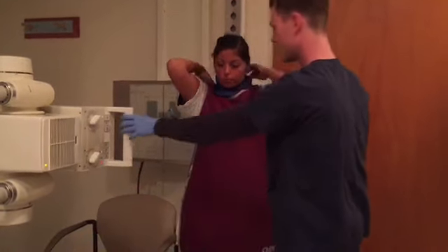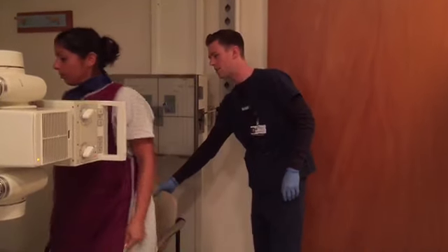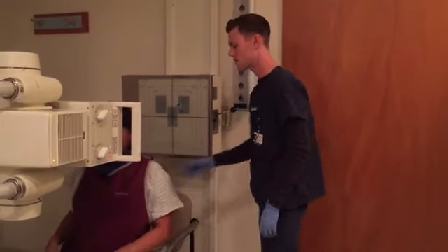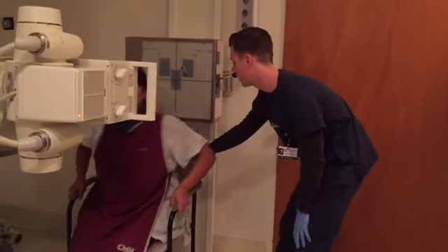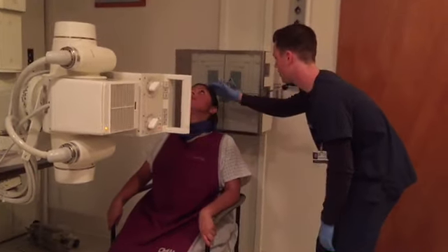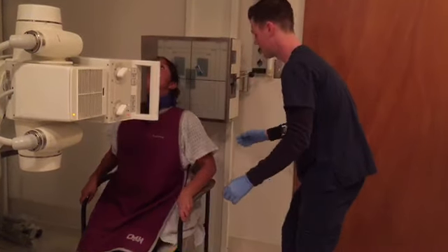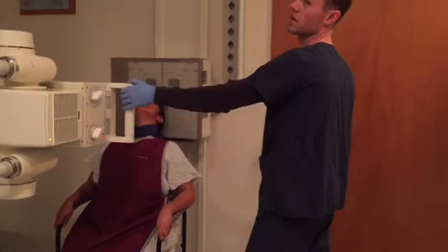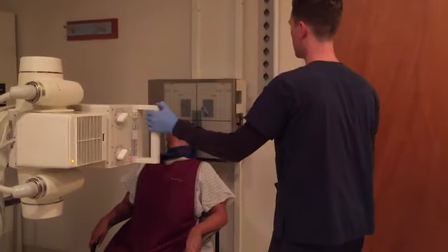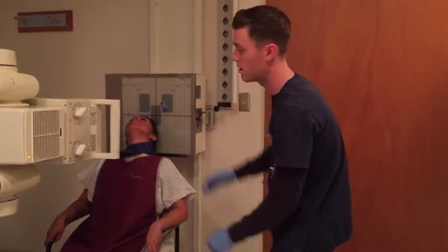Okay, Evelyn, go ahead and take a seat there. Sit towards the edge of the seat, that way you can lean back. This one's going to be a little uncomfortable to do, so go ahead and lean against the back of the chair. And then put your head back so that the top of your head is up against the board. You can scoot the chair back a little bit. Okay. So for this one, the central ray is going to be horizontal again, and it's going to enter 3/4 of an inch anterior to the EAM.